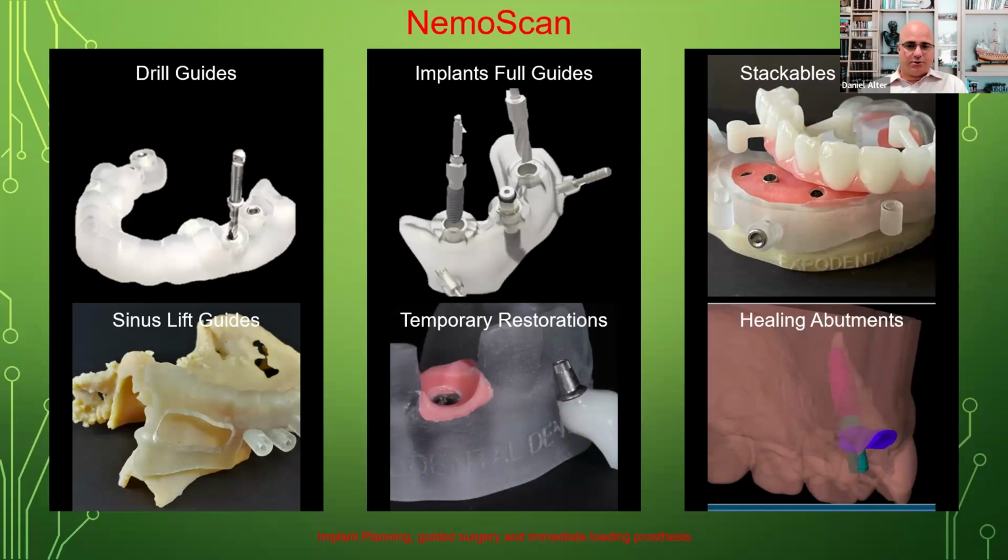And if you look at a laboratory like yours, who are most of our clients in a laboratory? They're general practitioners.